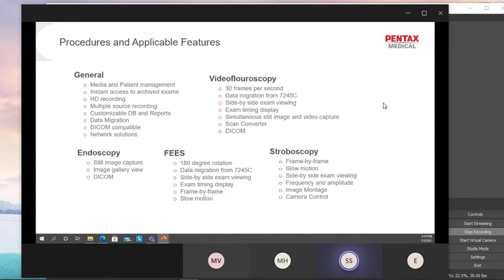To help the physicians, we came up with this 10 frames montage. So you see an entire closure and opening of the glottis. If in any one of the 10 frames they can see a picture where the vocal fold is closed tightly, it means it's closed. That will help a lot in the analysis of the doctor's decision afterwards, right? And of course, we have camera control, which I mentioned before.